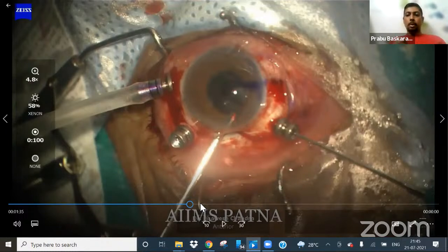Many a time you will be pulling, but the optic will be stuck. Even if you sweep just the iris, sometimes it may be a capsular cap. So unless you go under and then retract the capsule, the optic may not come. That's when probably the haptic-optic junction also gives way. Then the case gets complicated. So you should always make sure the path for the optic is good. That is something which I would stress, that it's very important.